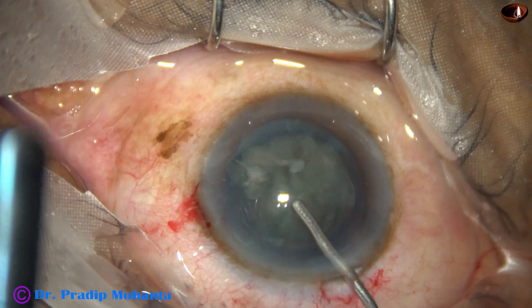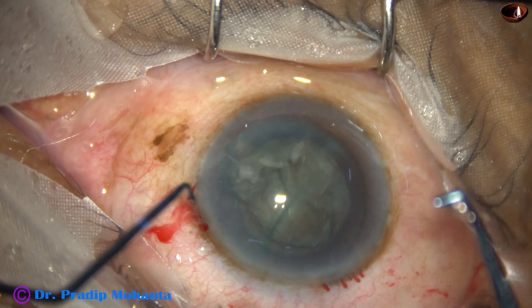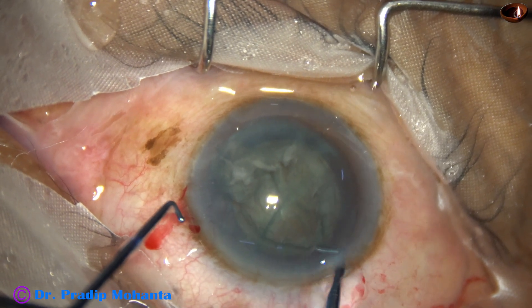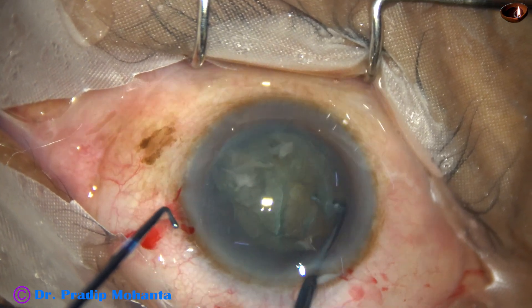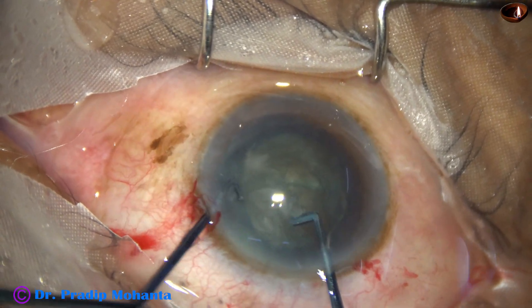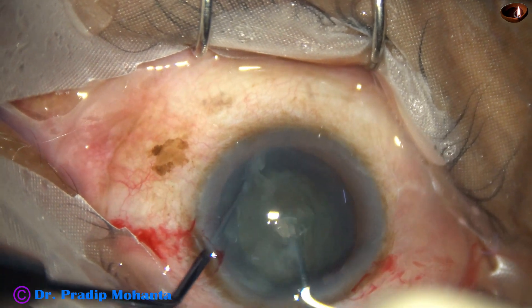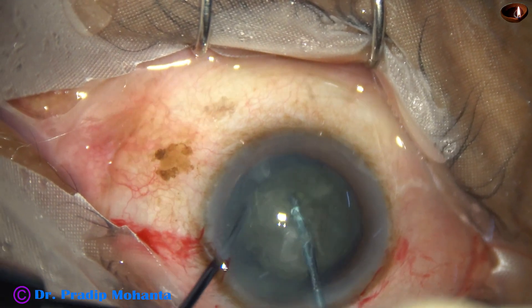We get three pieces — two hemi nuclei, and then one hemi nucleus is divided into two pieces. We can divide the other hemi nucleus also, but that is not necessary most of the time. But in this case I am dividing the other hemi nucleus also after injecting visco.